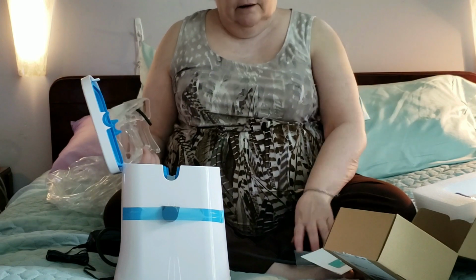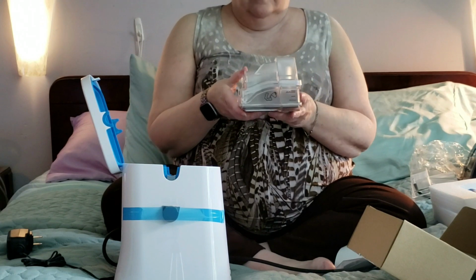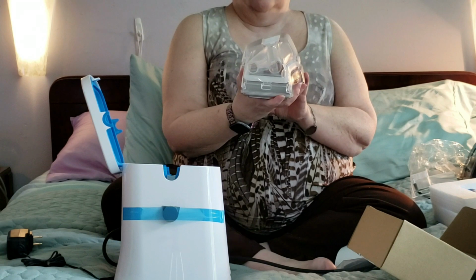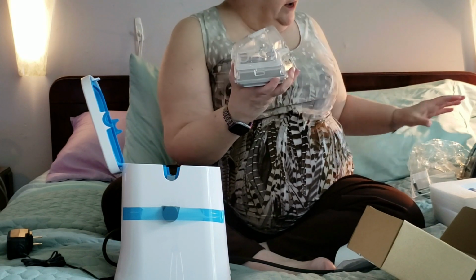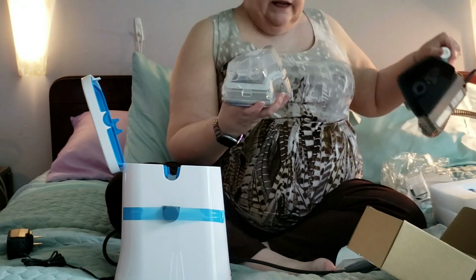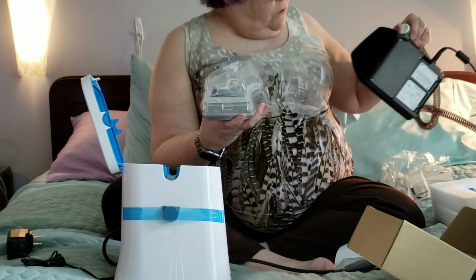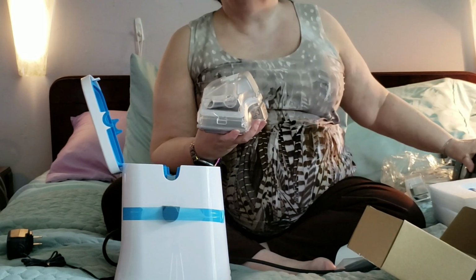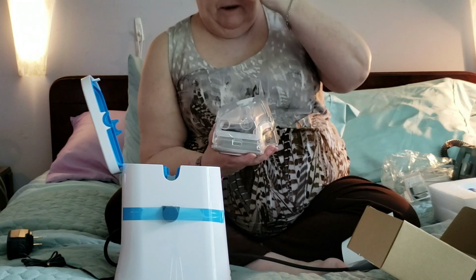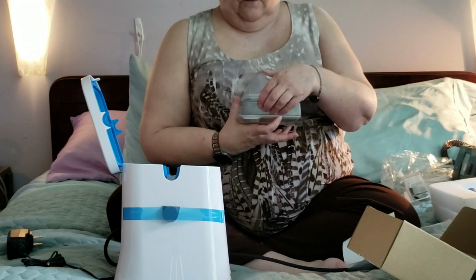There will be an infinitesimal pause for you anymore. This is the ResMed AirSense 10 humidifier. I showed it to people in my unboxing. The humidifier is an integral part. It is not something you can just add. I have not yet figured out if you can even use it without having the humidifier in there. You don't have to humidify your air, but I think you have to have it on. So it opens from the side.